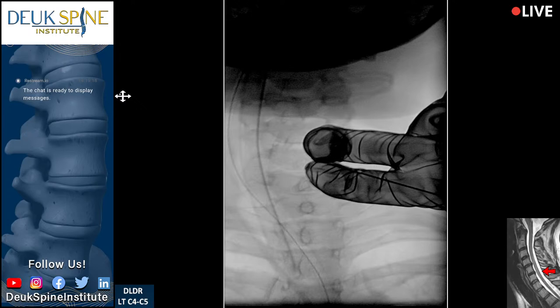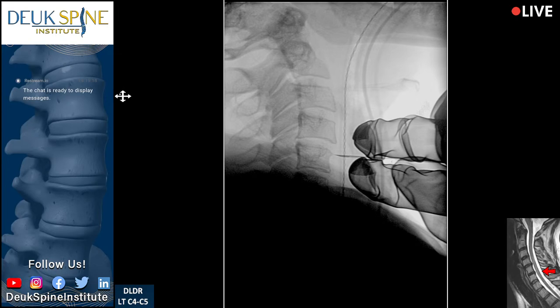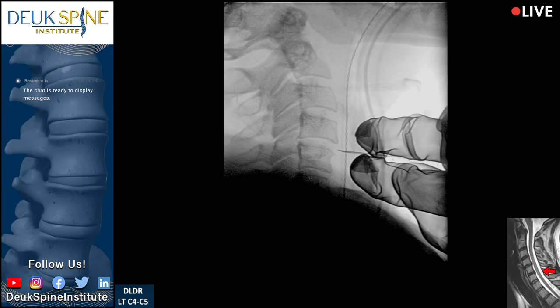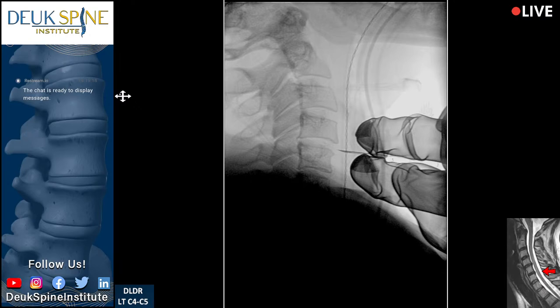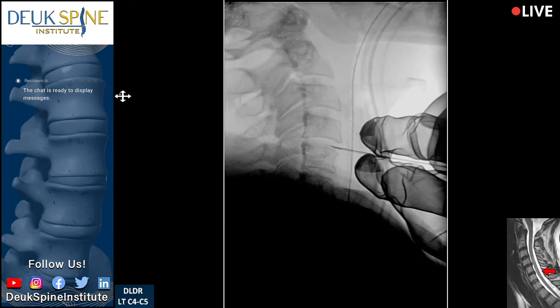I'm actually displacing her trachea and esophagus medially. You agree — north. You agree, Luis? AP quick — that's at four-five, everyone agree? Four-five is where we want to be. Lateral — that's perfect, we're right in the middle, dead center. You can see how I've pushed the esophagus way over — go back to the AP view.